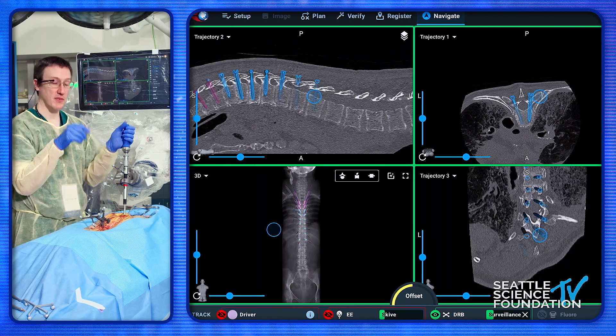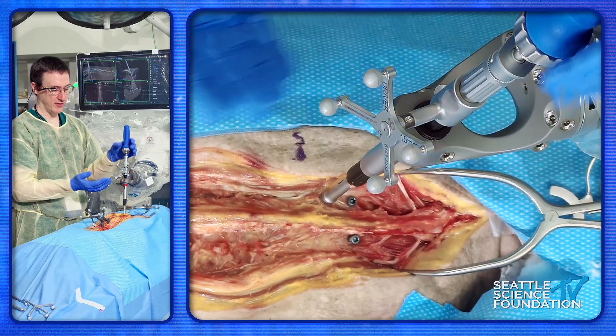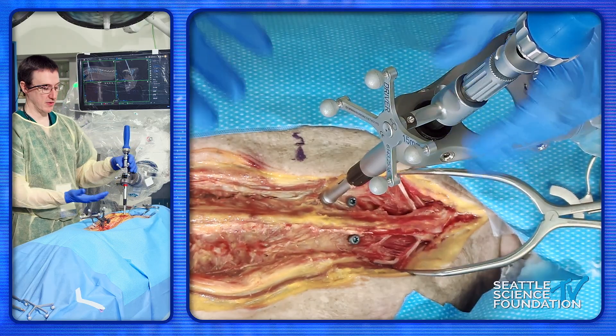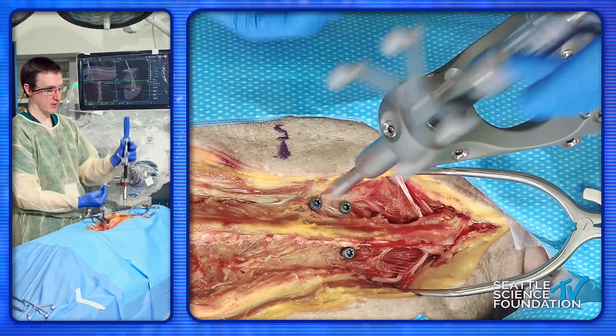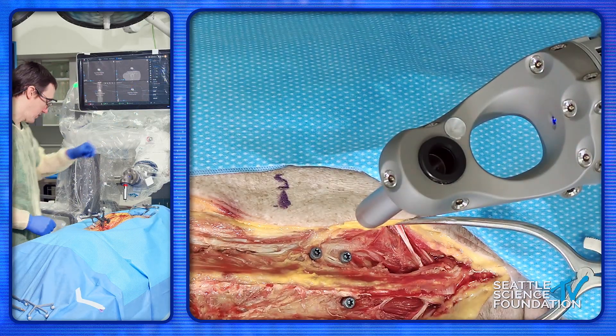You'll notice — I don't know if you can see from the overhead camera — but the spine is moving here as we're inserting this screw, and some of that force is being pulled up in this trajectory.